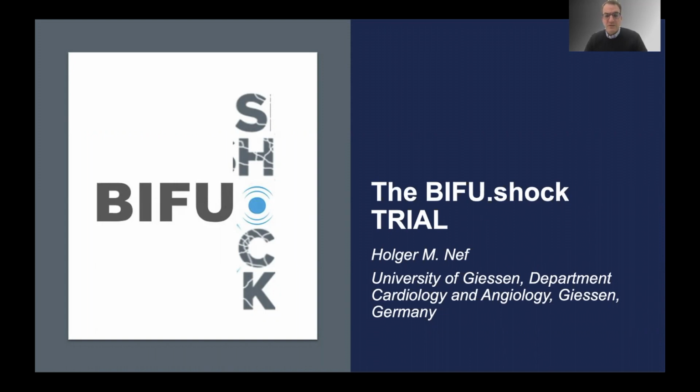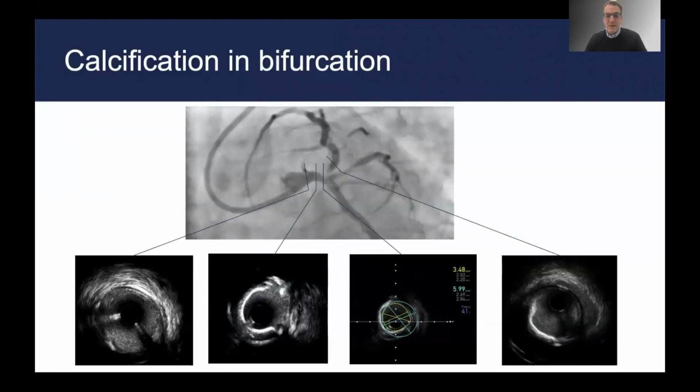I'm going to introduce you in the next 5 minutes to the BIFU.shock-Trial. As we all know, bifurcation lesions, even when moderate or severe calcified, are always a challenging situation in interventional cardiology.